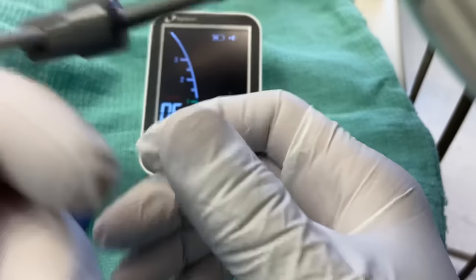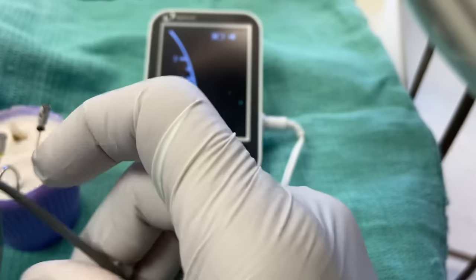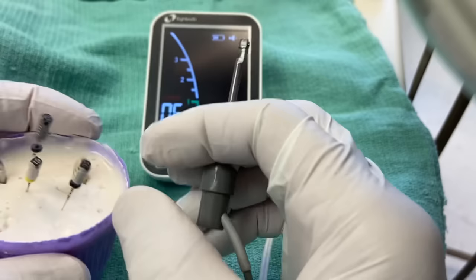Sometimes if your Apex Locator doesn't work, look at how brown and tarnished that is. It still has connectivity, but sometimes the clip gets tarnished after many sterilizations. So if you do this test and get nothing — like no response at all — before you run around looking for another Apex Locator, just take some steel wool and clean it up, or grab another file clip. You don't have to throw it out. That's our pre-takeoff checklist.